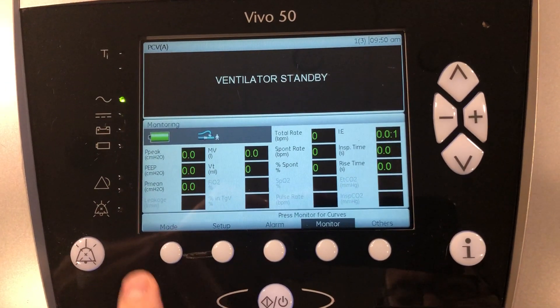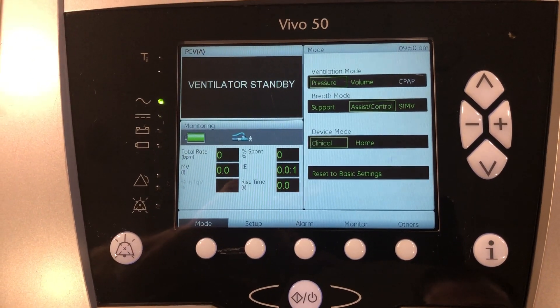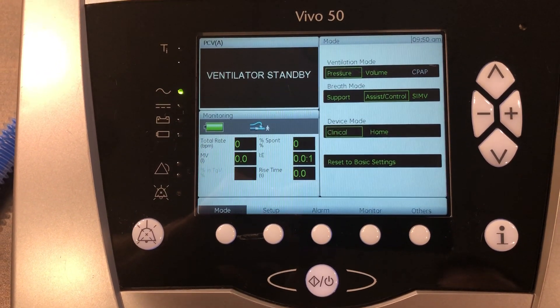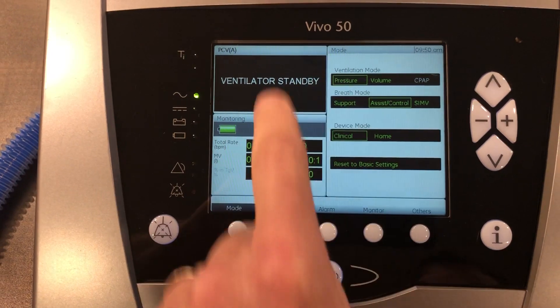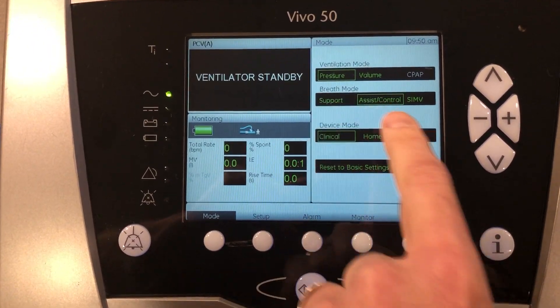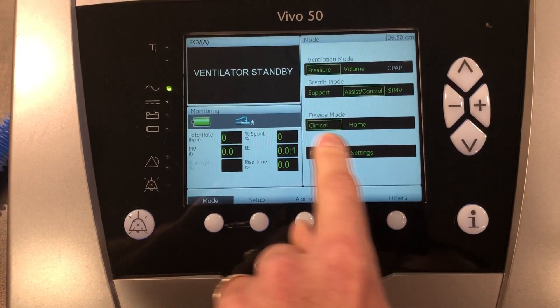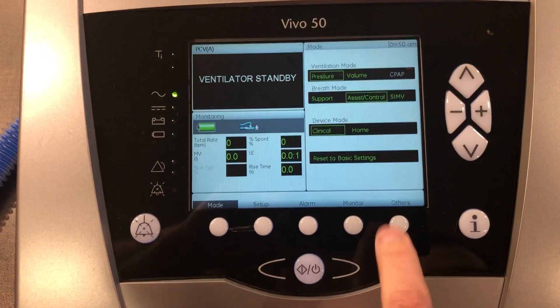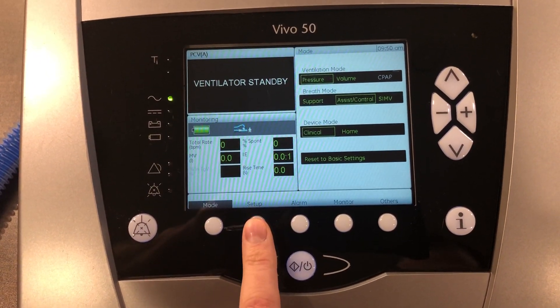So now what we want to do is go into our mode. You'll see that since we're doing inverse ratio ventilation, we want to be in a ventilation mode of pressure. We want our breath mode to be in assist control in this case. Again, this is going to be in a hospital setting, so we're going to keep the device mode clinical. And we're going to go to setup now.